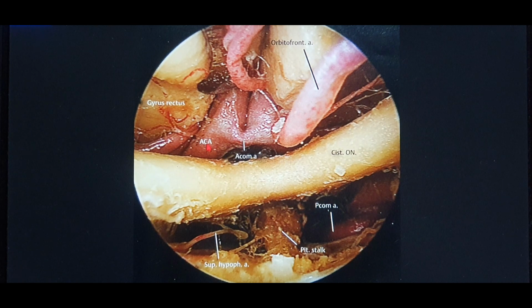So this is the anterior cerebral artery, that's the anterior communicating artery, and these are the branches of the A2 segment of the anterior cerebral artery. That's the orbitofrontal, the frontopolar, and this is the recurrent artery of Heubner. And you can see the superior hypophyseal artery right here. That's a branch of the ophthalmic segment along with the ophthalmic artery.